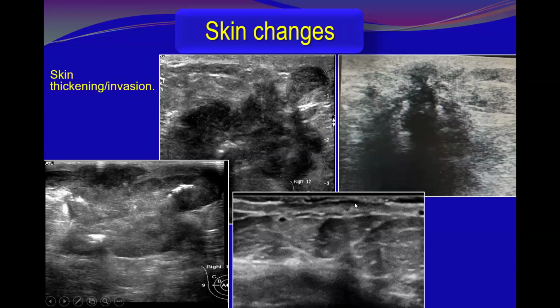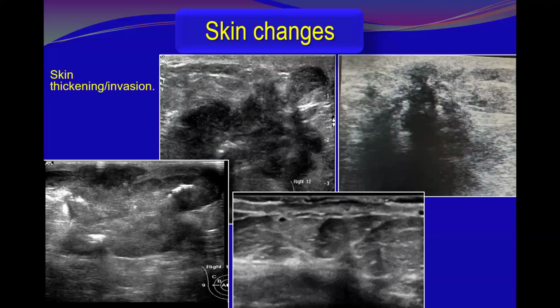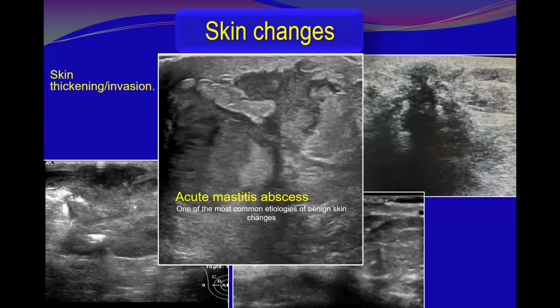And in this skin there is ulceration. This is a malignant ulcer. Though you could not see the lesion here, as it was isoechoic, there are some extensions and an indirect effect on the vascularity causing ulcers, and the skin was involved by malignancy in this elderly patient. All these are my patients.